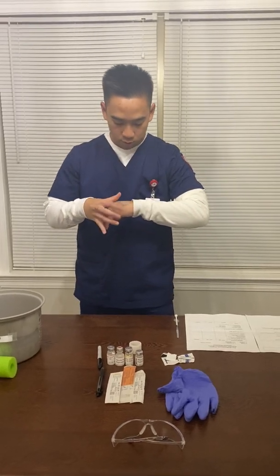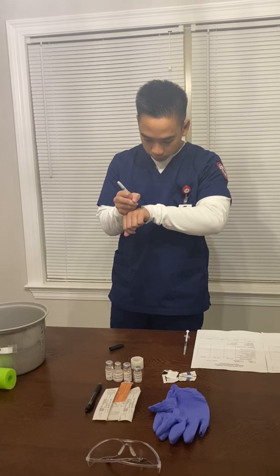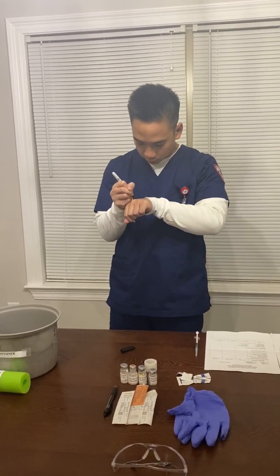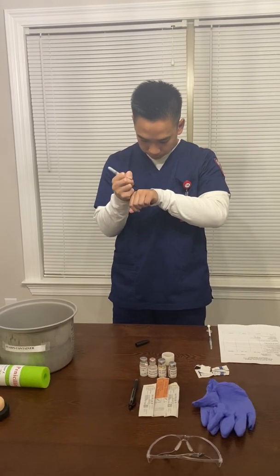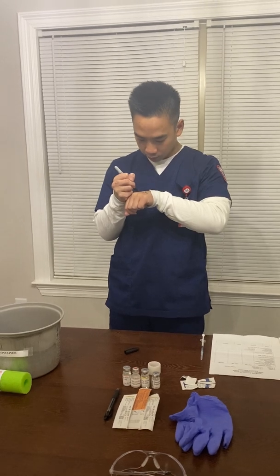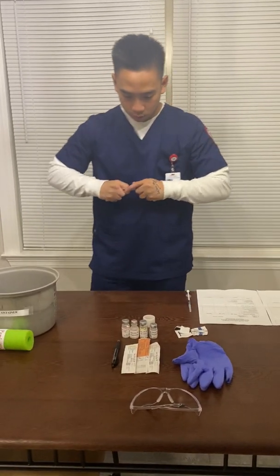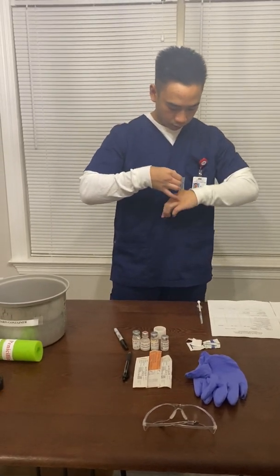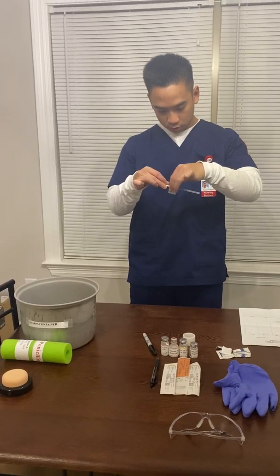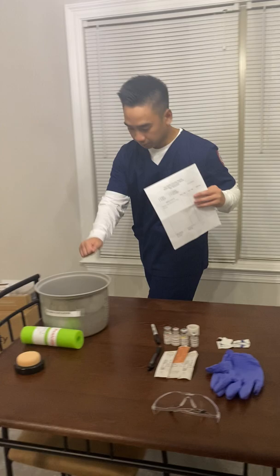After I do that, I'm going to create a label for my syringe. So on this label, I'm going to put the patient's name, the medication, the dose, and I'm going to initial it. Attach it to the syringe. You're ready to enter the patient's room.